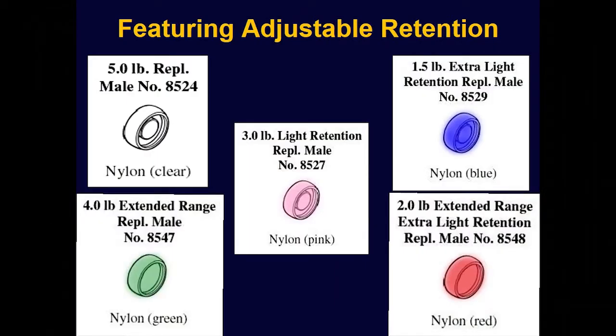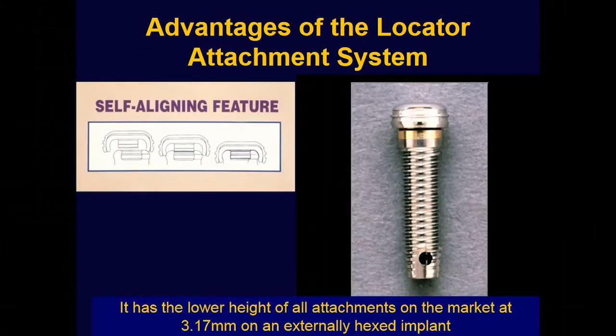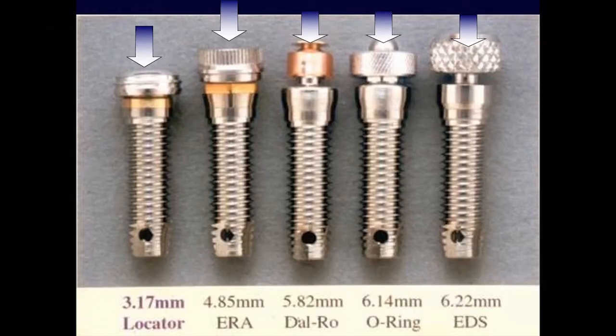They actually have more colors than this. For the most part, we use blue. It's 1.5 pounds of retention. If you try to put in 4 of these, they cannot get it out because that winds up being 20 pounds. But it's got a lot of advantages. It self-aligns. Like I said, it doesn't require as much vertical height as some of the other attachments that are out there, including O-rings. So it seems to be the best thing out there.